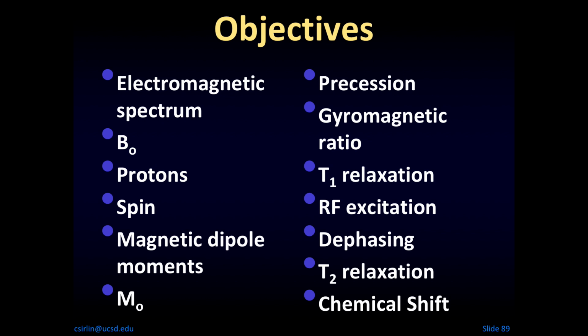These protons, or these magnetic dipole moments, that initially are lined up with or against the magnetic field, will over time line up with the magnetic field by losing energy to the so-called surrounding lattice, and that is known as T1 relaxation or spin lattice relaxation. T1 relaxation is governed by an exponential equation that was defined by Felix Bloch, and according to T1 relaxation, every T1 time you go from where you are towards equilibrium by another 63%. So after one T1 relaxation time, you're 63% recovered. After 2 relaxation times, you're about 85% recovered. After 3 T1 relaxation times, you're 95% recovered, etc.